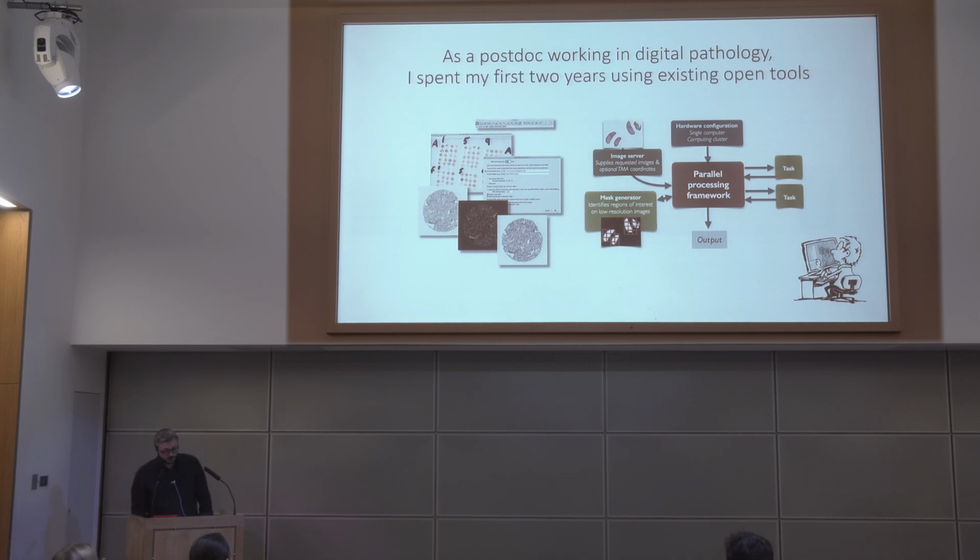So as I started my postdoc, I spent the first 2 years trying to use existing tools. I wrote some ImageJ plugins, a really convoluted Python-based parallel processing framework. They were horrendous to use.